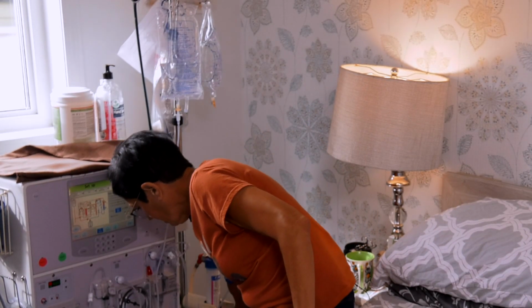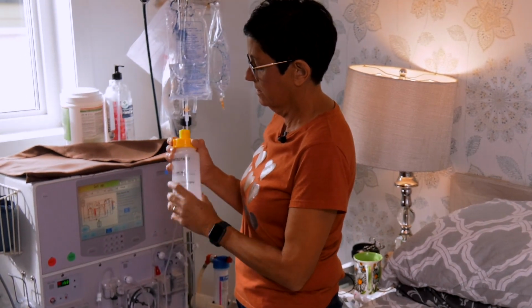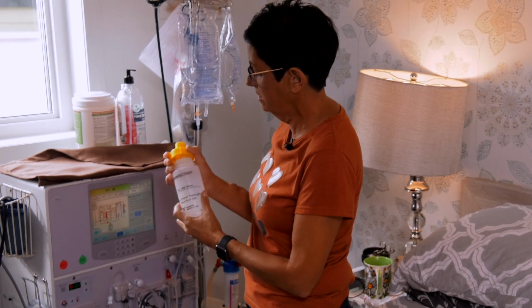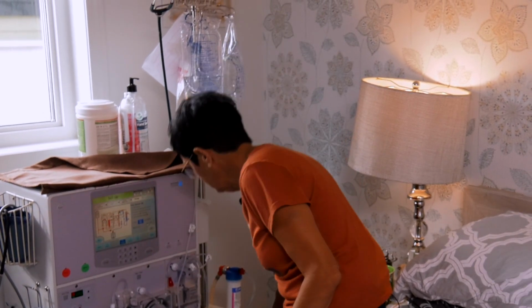Once a week, you have to bleach your machine. So you'd fill this up to the line, you hook it up to your machine, and it disinfects the machine.